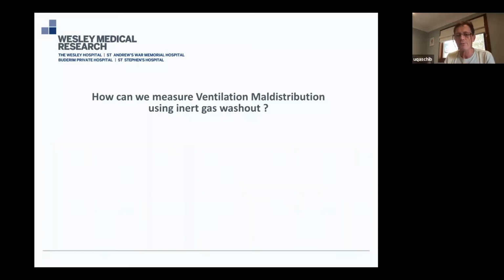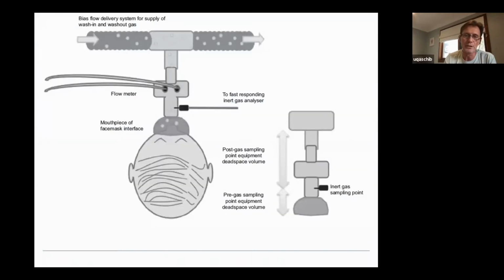Or do I have acinar space that is cycling, opening, or closing? Then convection is happening in there. Or do I have acinar space that just is not participating in the gas exchange? So, diffusion-dependent processes. So if I have a tool that can separate convection-dependent ventilation maldistribution from diffusion-dependent maldistribution, can we separate the two? Because they are two important factors in improving ventilation distribution.